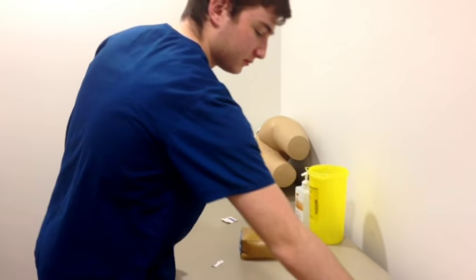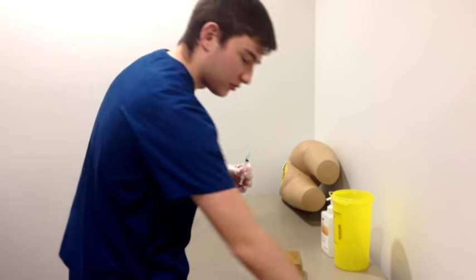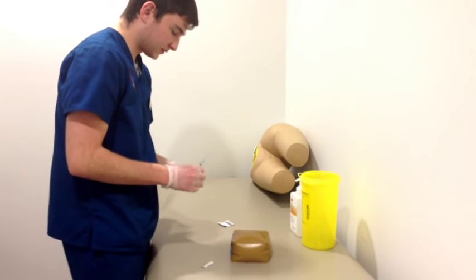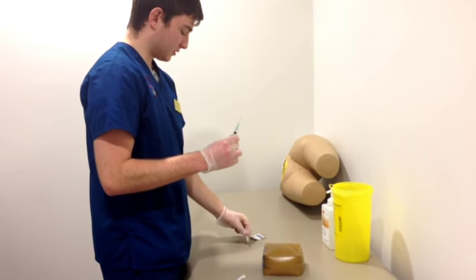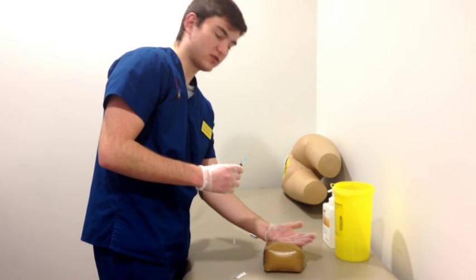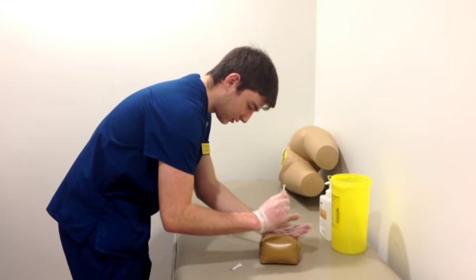I will grab my medication, making sure again it's the right medication that I have drawn, checking with the MAR one last time. So yeah, 0.5 milliliters of Haldol, perfect. I will then take off the cap. I will then put my hand onto the patient, and using Z tracking method, I'm going to pull the skin around 2.5 centimeters to the side, injecting straight into it.